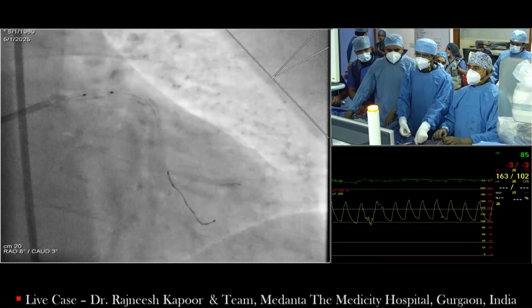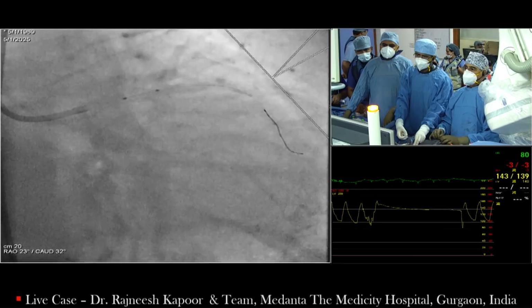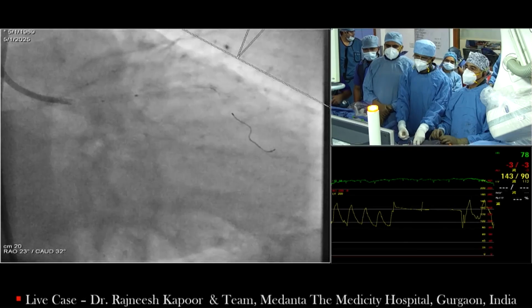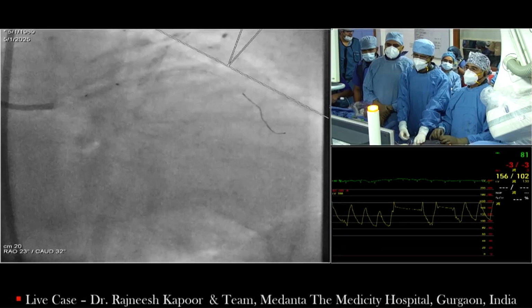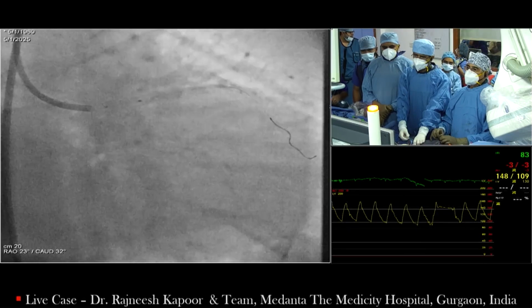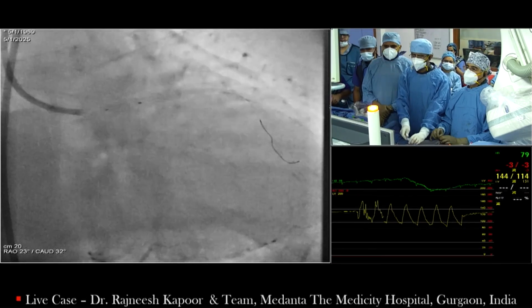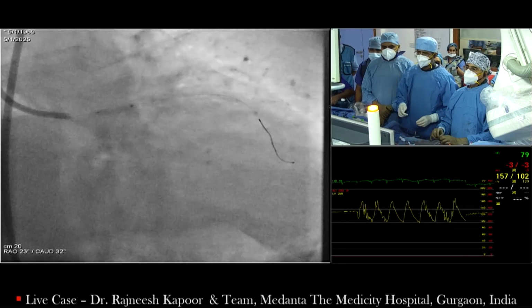The only thing is, I think Goran was clearly pointing out that left main to LAD, but in my mind I want to take a chance with ostial placement. Rajneesh, I don't think we should make that decision now. Anyway, after lesion preparation you will repeat OCT and then you can decide. Yes, right. Go up, 18, 20, down, and then decide.